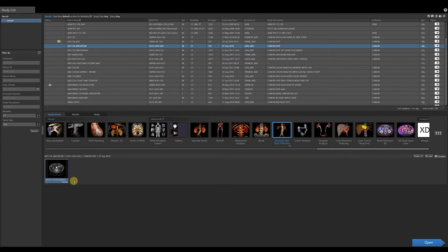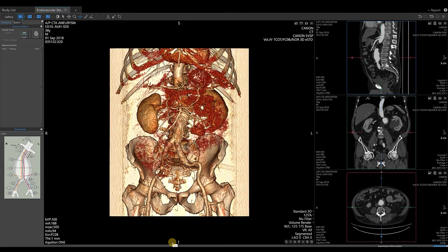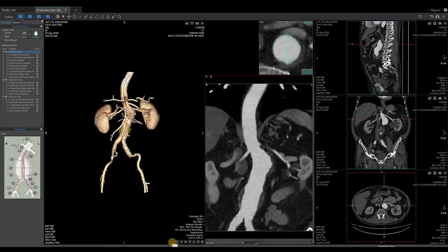Verify the series used to work up the application is highlighted blue. To launch into the viewer, either double left click on the endovascular stent planning application or select the open button in the bottom right-hand corner. After the application launches into the viewer, note that the common aorta, the right aortic iliac, and the left aortic iliac are automatically probed by the application.